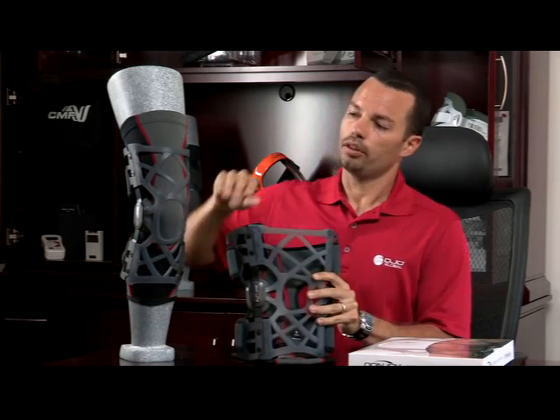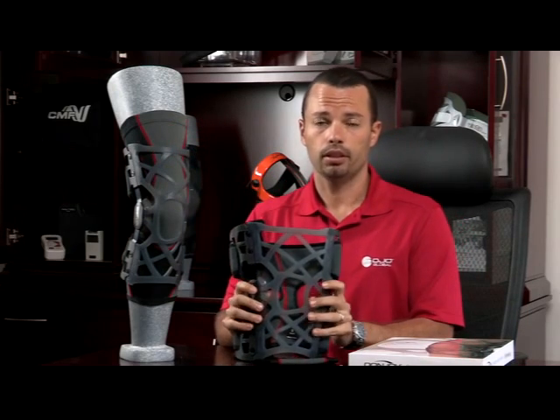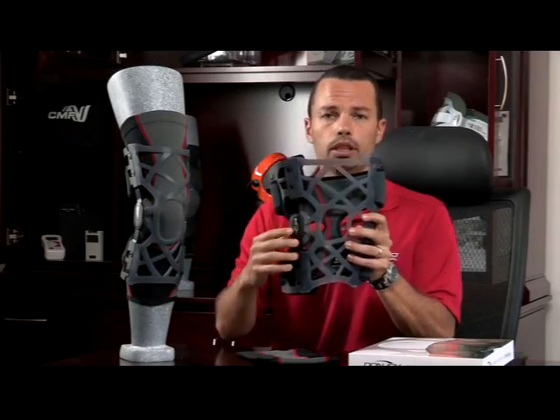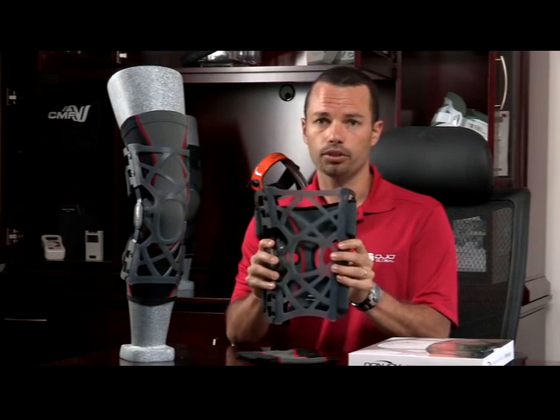First, as you can notice, there's a web in the front of the knee. The web does a couple of things. It helps absorb shock like a spring for your knee. It also helps pull the hinge in toward the knee to help you get some offload on the bad side or painful side of your knee.